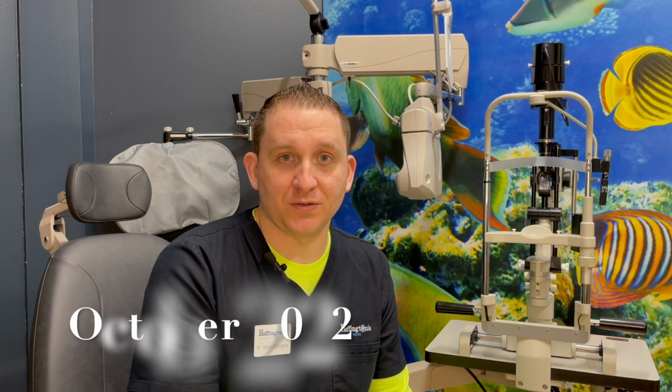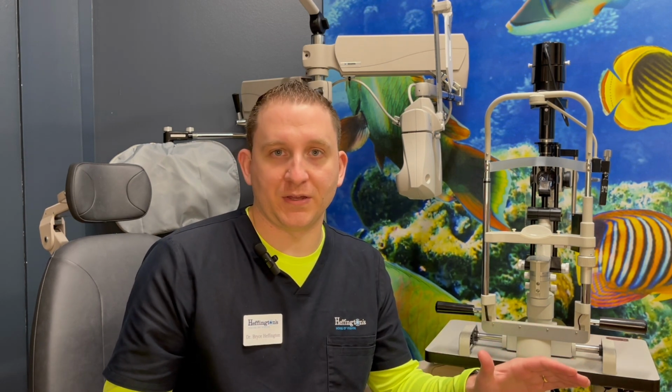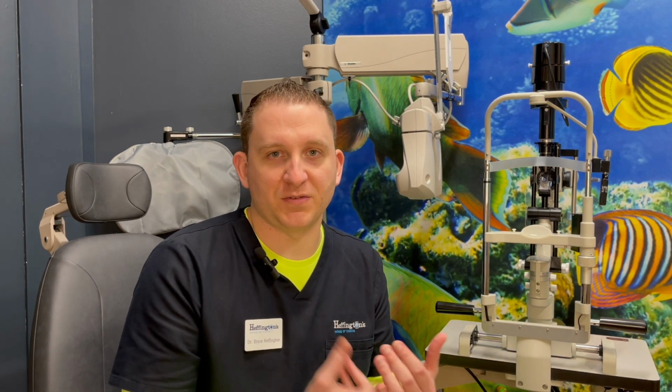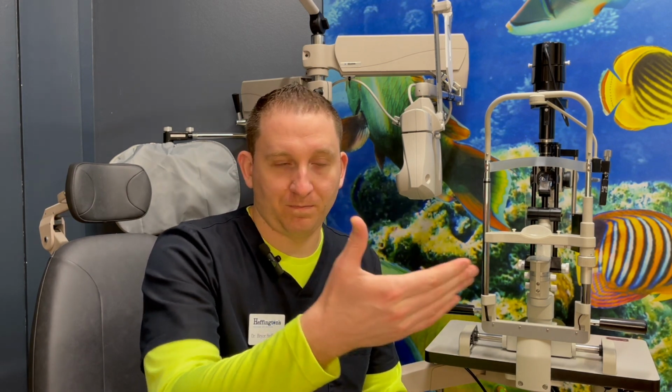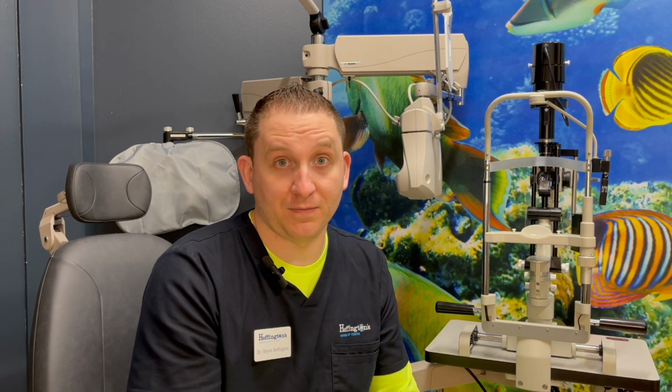This is a fundus photo of the back of my eyeballs that we took in October of 2022 with the instrument that we use here in our office. Right now we use the Maestro. It's pretty cool because this instrument used to be spread out over multiple instruments, like you used to have a fundus camera, an OCT, an exterior photography camera device, but now it's all combined in one to make it very handy for us to use.